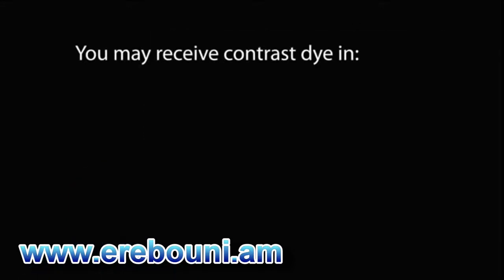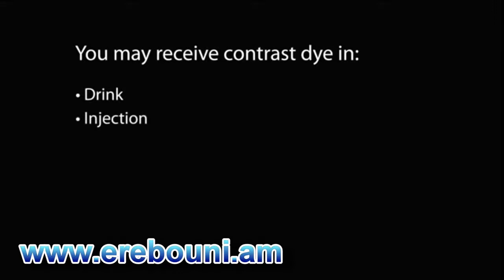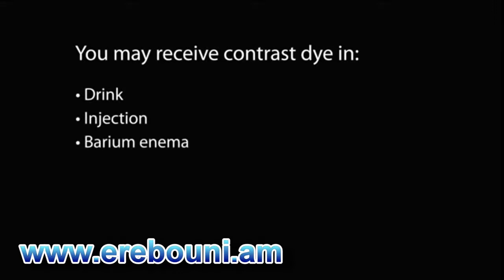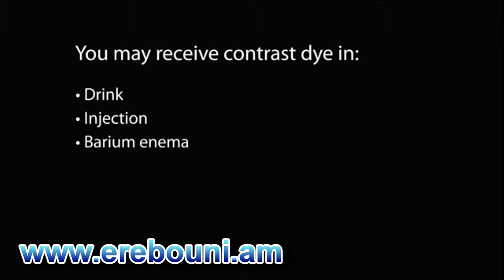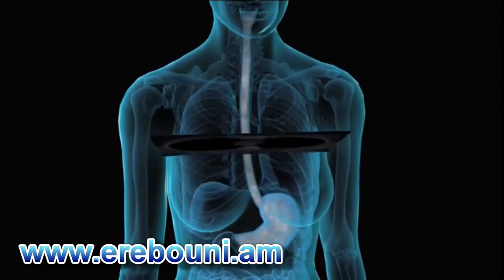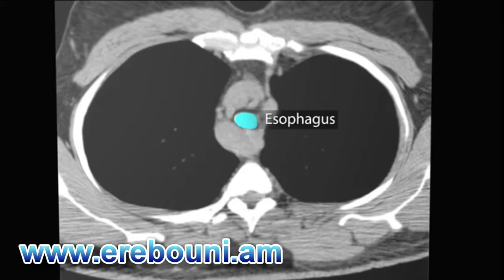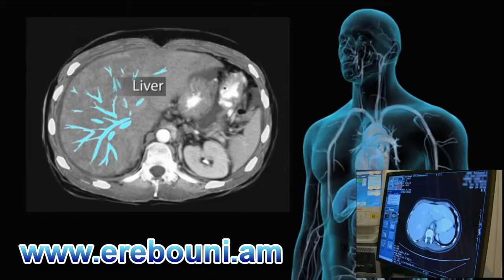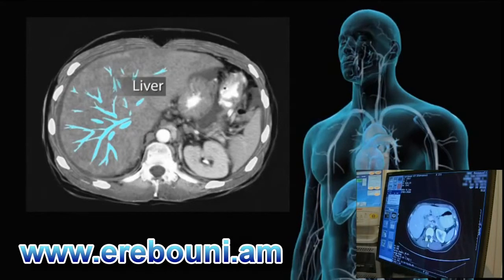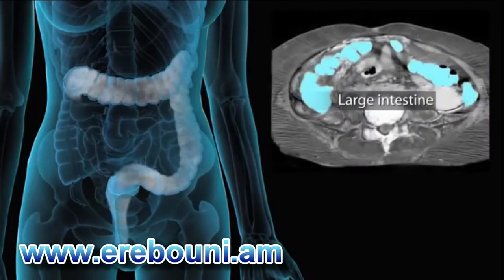In some cases, you may receive contrast dye before your procedure in a drink, an injection, or a barium enema to make it easier for your doctor to see certain areas of your body. If you received a drink with contrast dye, your esophagus or stomach will be highlighted. If you received an injection, your blood vessels, gallbladder, liver, or urinary tract will be highlighted. If you received a barium enema, your large intestine will be highlighted.